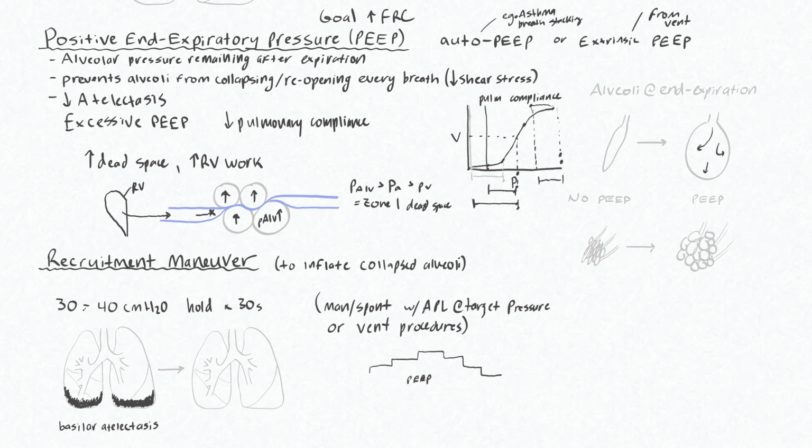The problem with this 30-second hold at 30 to 40 centimeters of water is that this is actually fairly intense, especially for these hemodynamic effects that we were just talking about. So this definitely will cause hypotension. And the degree of hypotension that you get is going to be related to the cardiovascular status of that patient. So if you get someone who is not doing so well otherwise, they may not be able to tolerate this recruitment maneuver, and you'd have to be very careful, especially if you don't have an arterial line to monitor what's happening with their blood pressure while you do it.